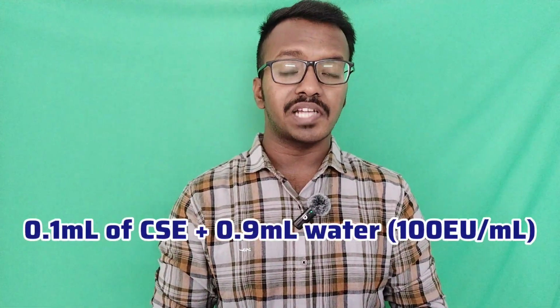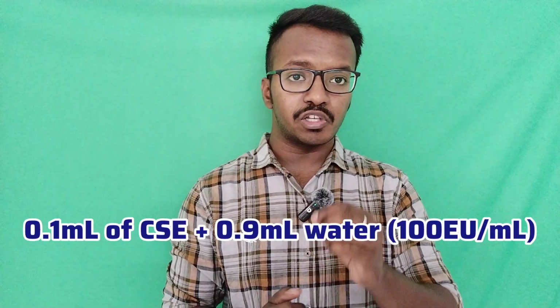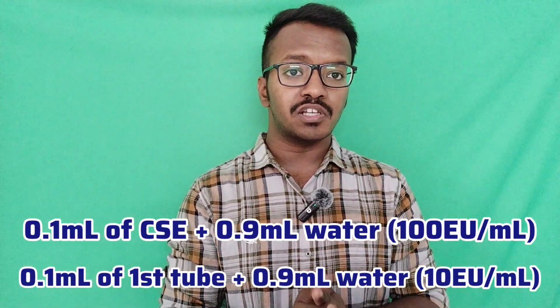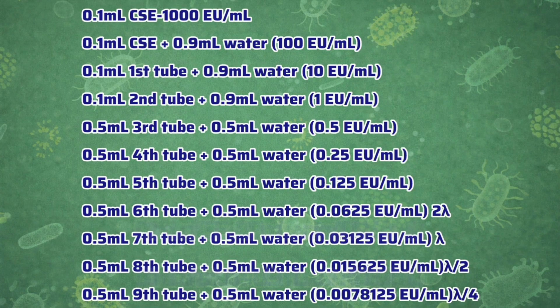With the help of a micropipette, take 0.1 ml of controlled standard endotoxin and mix with endotoxin free water. Now we get 100 EU per ml. Again, take 0.1 ml from the previous tube and mix it with 0.9 ml of endotoxin free water. Now we get 10 EU per ml. Like this image, we need to dilute our sample up to 0.03125 and the below values.